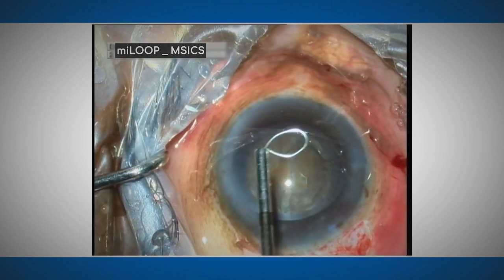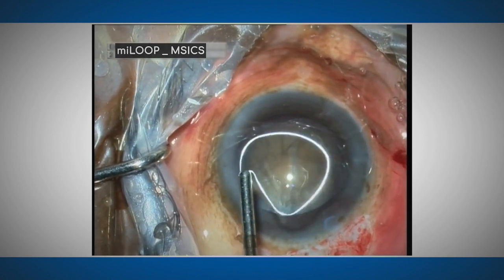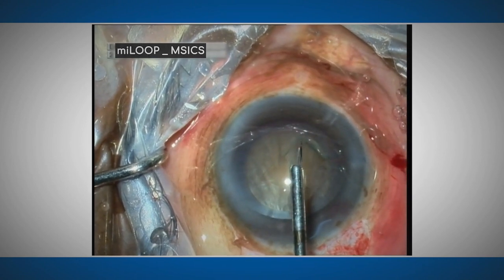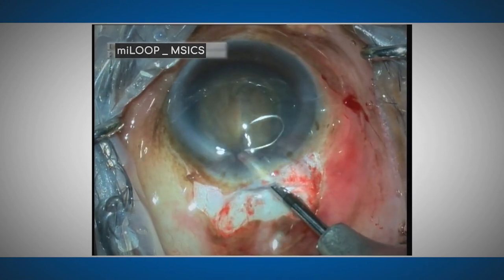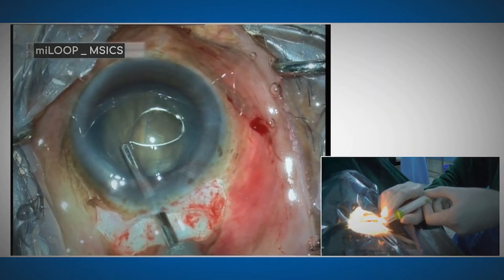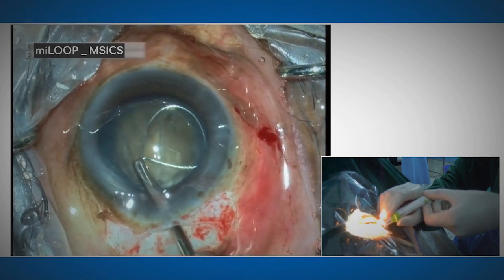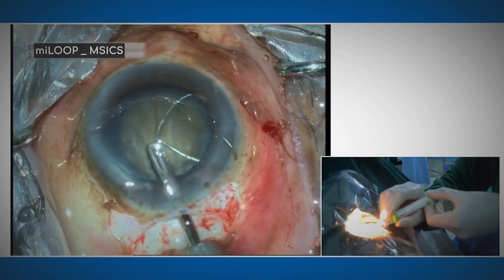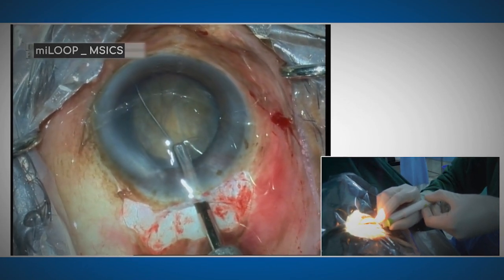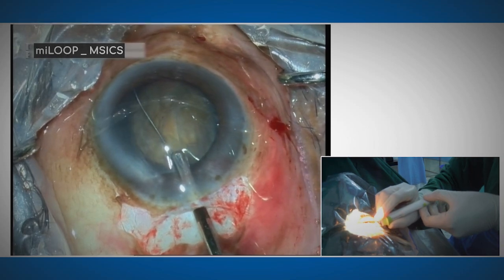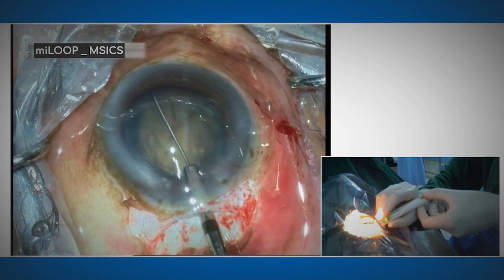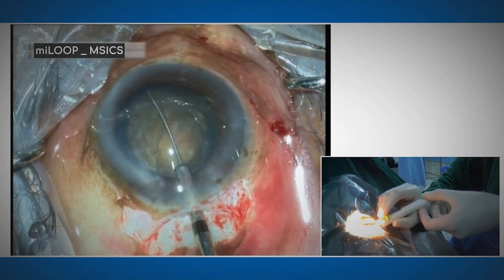After completing a five to five-and-a-half millimeter capsulorhexis, viscoelastic is injected under the rhexis margin to create space for introducing the My Loop. The My Loop is then inspected to confirm that the loop is fully retracting and extending prior to entering the anterior chamber. The My Loop tip is introduced into the anterior chamber with the loop inserted first, followed by the body of the instrument. The loop is then gradually opened horizontally just under the anterior lens capsule. Once the loop is fully opened, the surgeon rotates the instrument so that the loop becomes vertical and sandwiches the whole nucleus inside the loop.